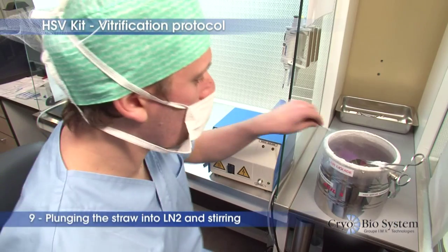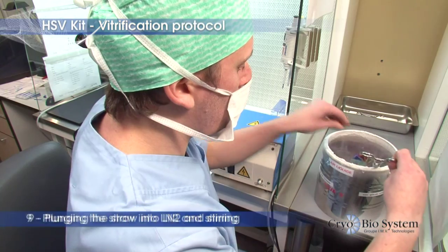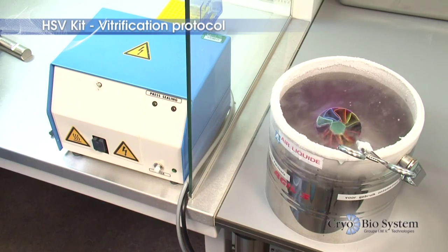Immediately immerse the HSV straw in a liquid nitrogen bath while making circular movements to prevent the formation of any insulating air layer. Transfer the HSV straw to its storage device.